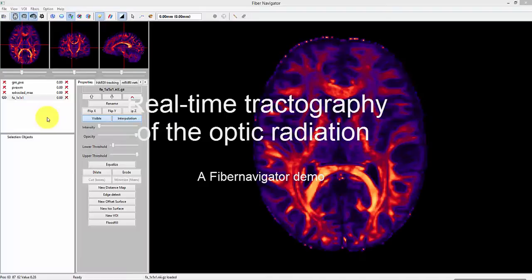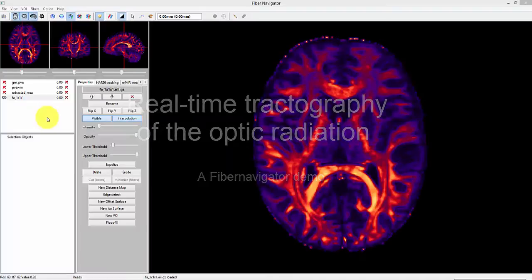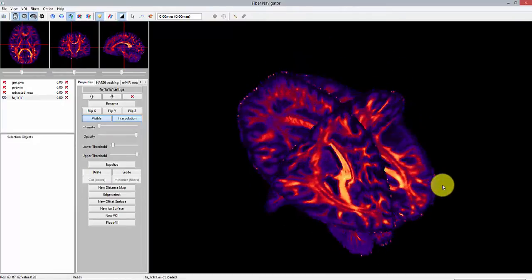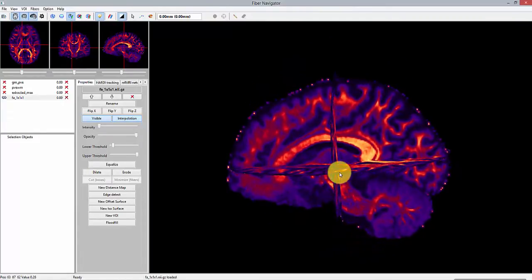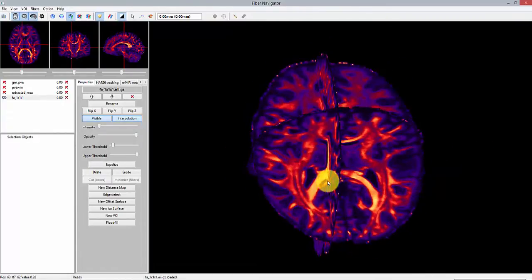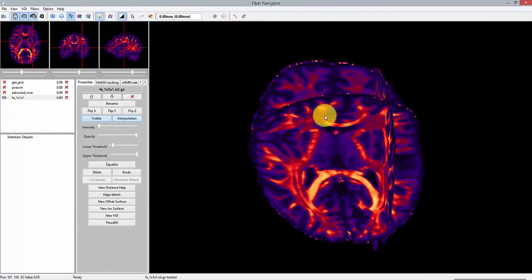Hi, this tutorial shows how to perform real-time tractography of the optic radiation using the fiber navigator. We're going to be using the human connectome data.